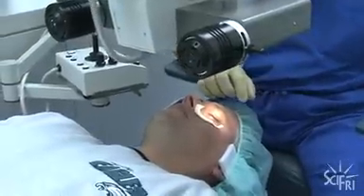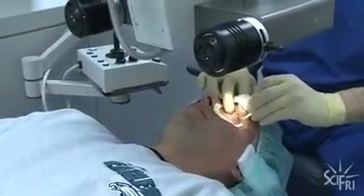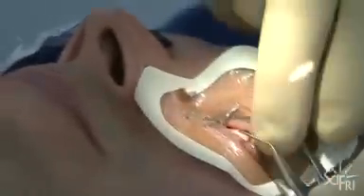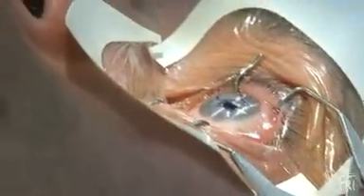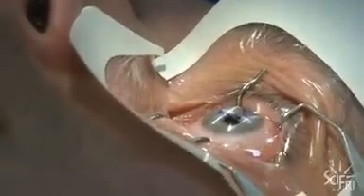So there's numbing medication topically placed in the eye a couple of times. And we put sterile drapes on the eye to keep our field clean, and then place the speculum to hold the eye open. After the speculum, Dr. Vale marks the eye, which helps him locate the astigmatic axis in patients having an astigmatism corrected. The marker also helps Dr. Vale realign the flap that he's about to cut.